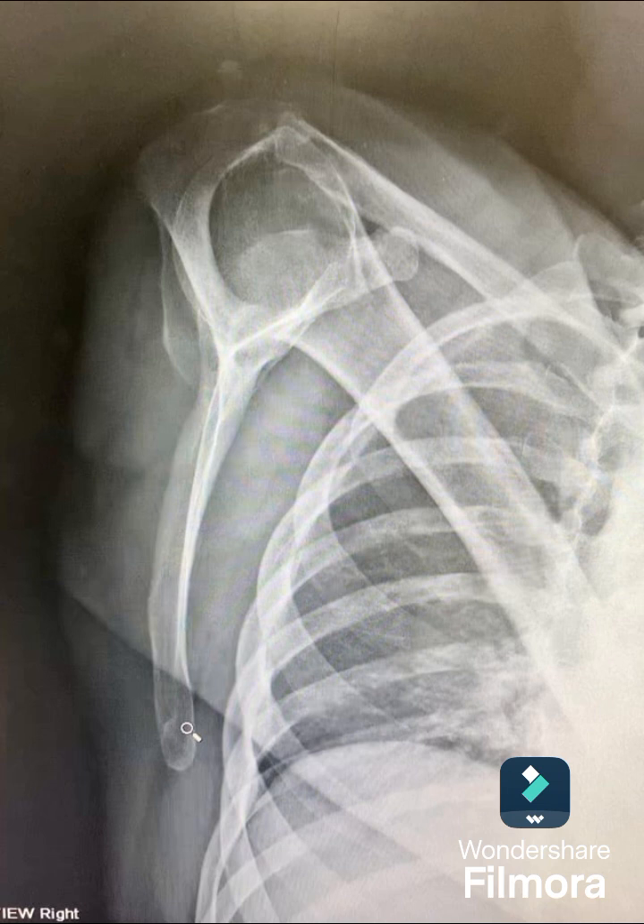Personally, I would use 72 inches SID instead of 40. The textbook will say to use 40 inches minimum — it's not mandatory, but it needs to be at least 40 inches. Going back to your image critique factors: at 72 inches, that reduces magnification, you have better detail, less patient dose, and it does put more wear and tear on the tube. However, I do everything at 72 inches — you get a better picture and there is less movement artifact. The more distance, the better.